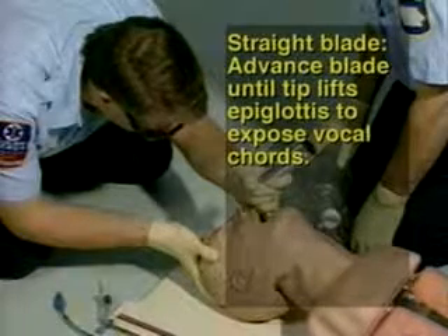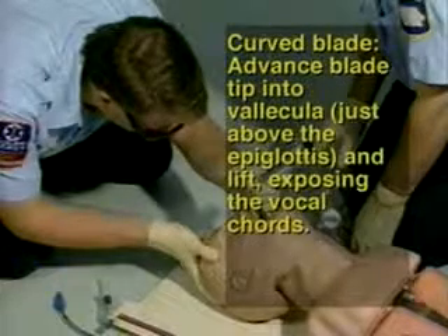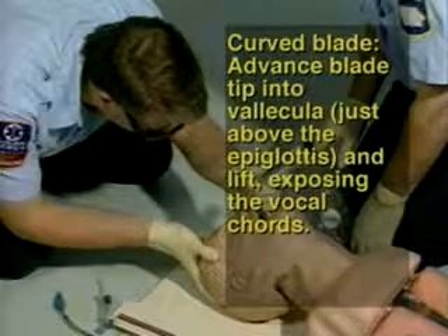Step 9 — Straight blade: Advance the blade until the tip lifts the epiglottis to expose the vocal cords. Step 10 — Curved blade: Advance the blade tip into the vallecula, just above the epiglottis, and lift, exposing the vocal cords.